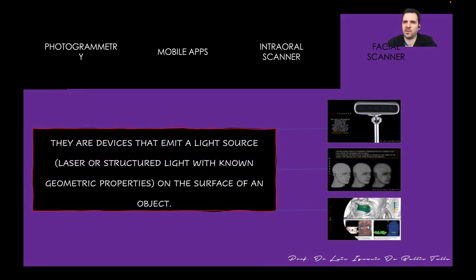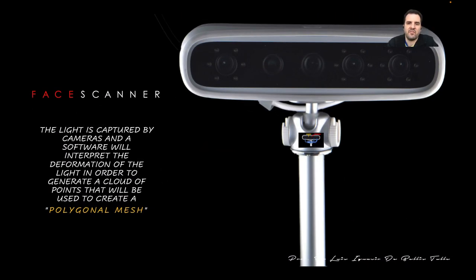And here is where things have started to become interesting. A facial scanner works in a similar way to how an intraoral or a lab scanner works. Many of them emit a structured light. Others emit a laser.